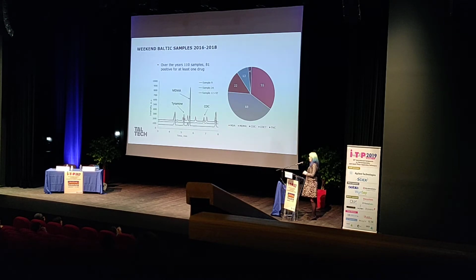We also tested the method on real samples with the instrument on site, in cooperation with the Estonian police, for 3 years at the Weekend Baltic Festival in Pärnu, Estonia. We collected over 110 samples from people under suspicion of being intoxicated.